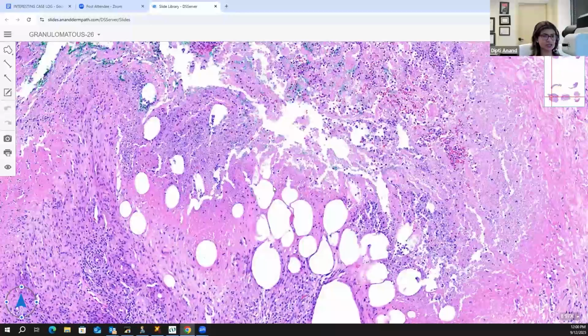They can ask you multiple second order questions. They show you the slide and they can ask you referring to any one of the things that I've talked about. What are your next steps? Yes, you're going to look for a foreign body, but most importantly, you're going to do an infectious workup. Your infectious workup would include markers like PAS, GMS for fungus, acid fast, and Fite. The least important would be to do a Gram stain because classic bacteria like a furuncle doesn't produce this dirty necrosis. So you typically don't think staph doing this.